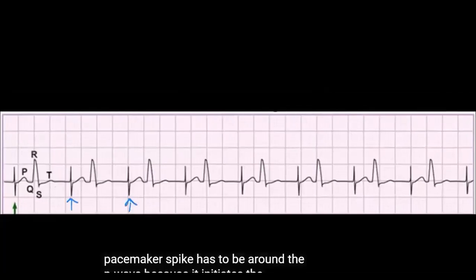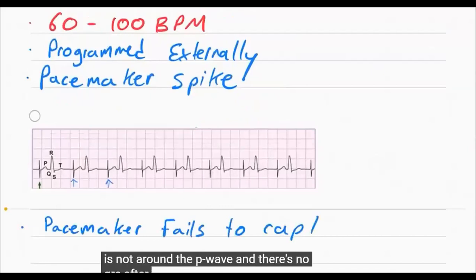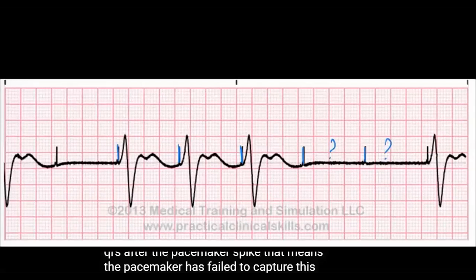If a pacemaker spike is not around the P wave and there's no QRS after the pacemaker spike, that means the pacemaker has failed to capture. This means there's issues with the pacemaker that need to be resolved.